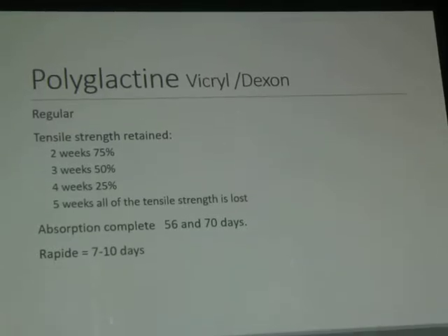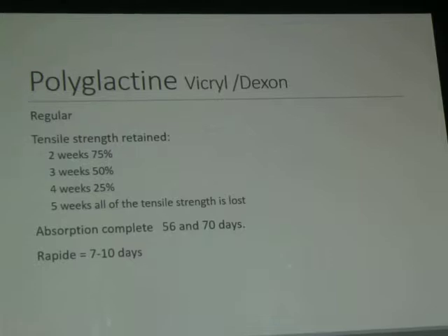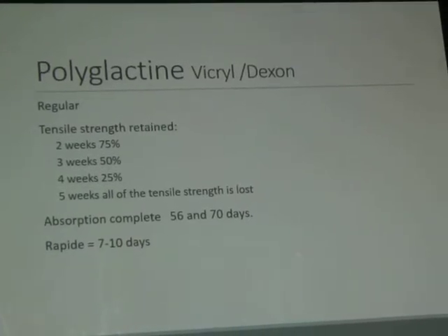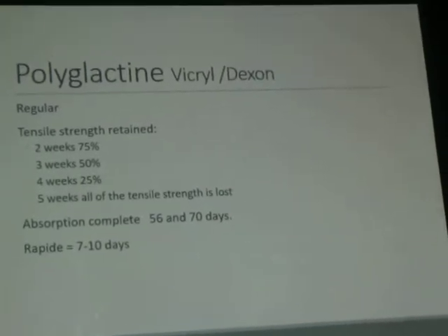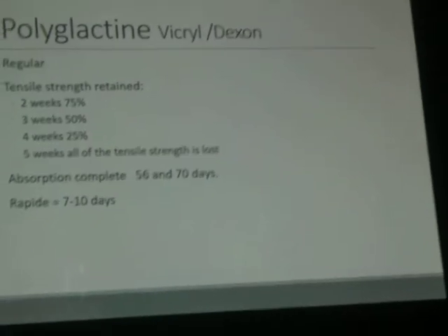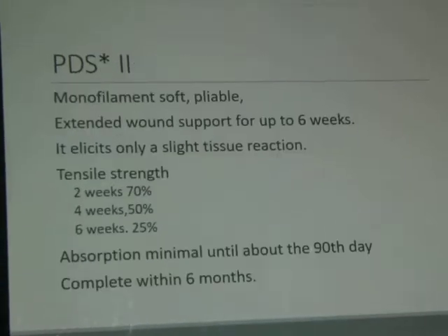It's a very rapid thing. Rapid يعني سريع. It dissolves very rapidly. You should not use this type of Vicryl for support of tissue, just for skin suture. And usually it is undyed and used for plastic closure and aesthetic closure of the skin.